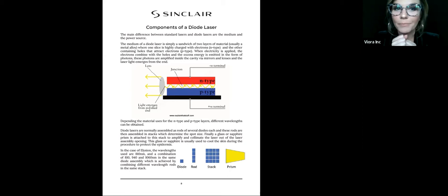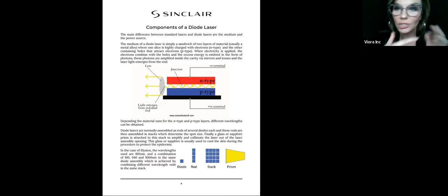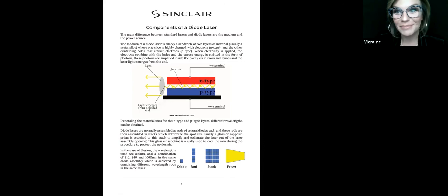And again, we have two mirrors, same with the diode, and those photons are bouncing back and forth and they start to line up with one another. And then out comes our laser beam. So very similar, but also very different. Depending on the materials used for the N-type and the P-type, that's how you get different wavelengths. You can have any type of wavelength that you want in a diode, just by using different materials inside. Again, who thought of this? It's amazing. Geniuses out there.